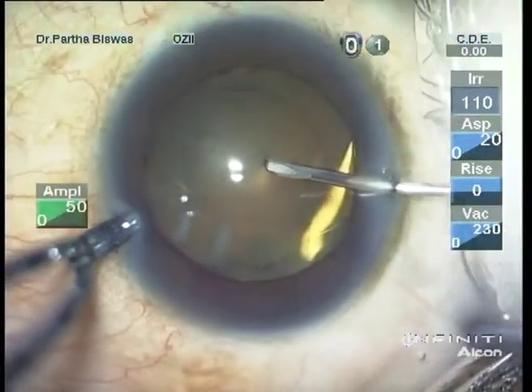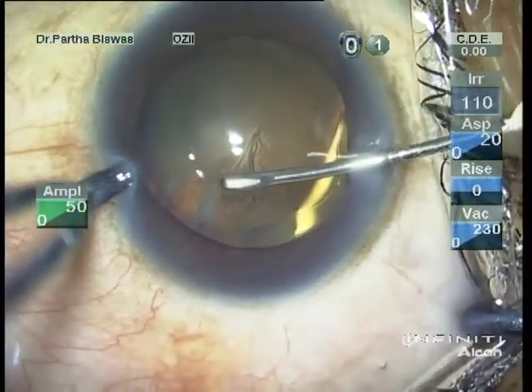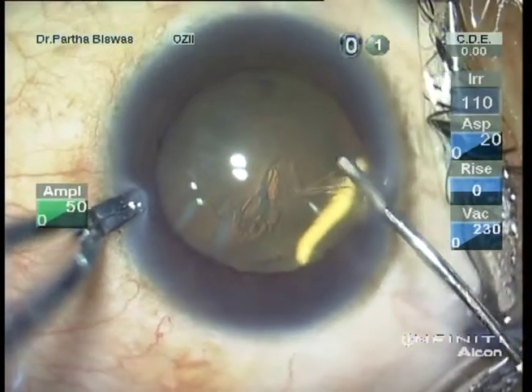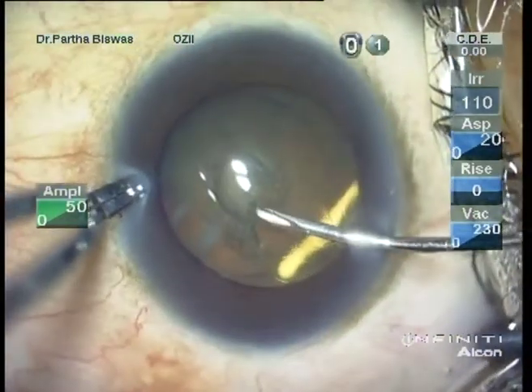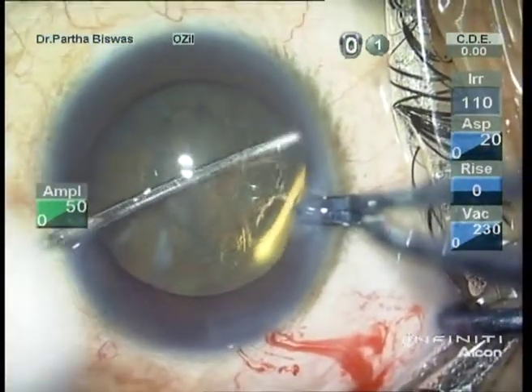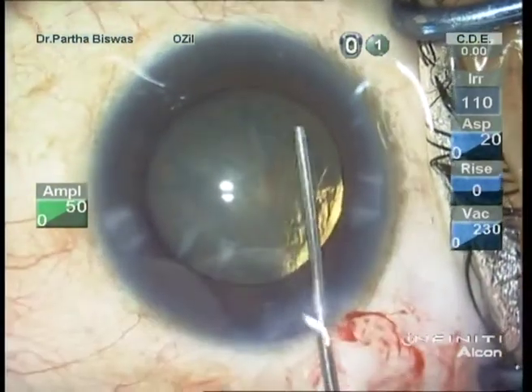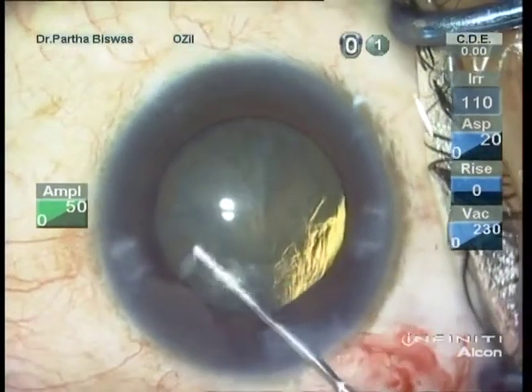A central curvilinear circular capsulorhexis is a prerequisite, but any existing ruptured capsule, and this capsule definitely had a rupture, was the entry point of the Ozurdex into the lens, and the rupture was existing. The nucleus management, keeping intact the implant without a nucleus drop, was the first challenge. The anterior capsular rim is separated manually from the nucleus. Very gentle and controlled hydrodissection to enhance the mobility of the nucleus and to aid the management of the nucleus.